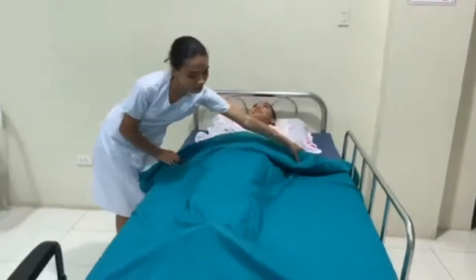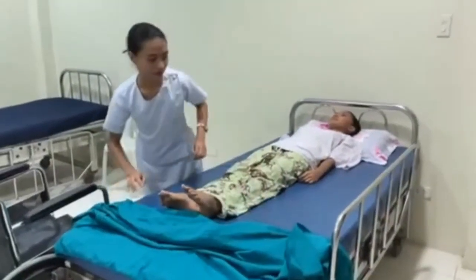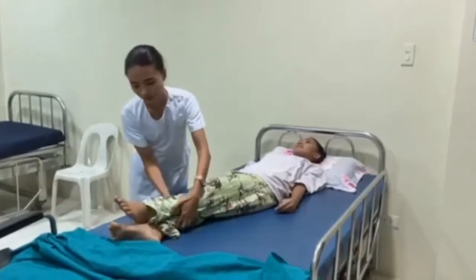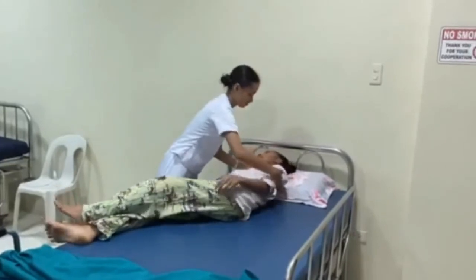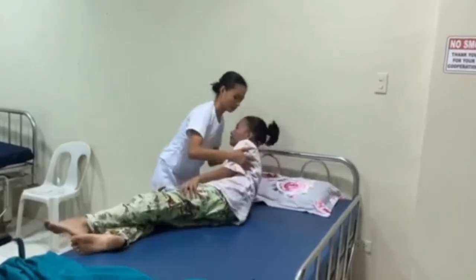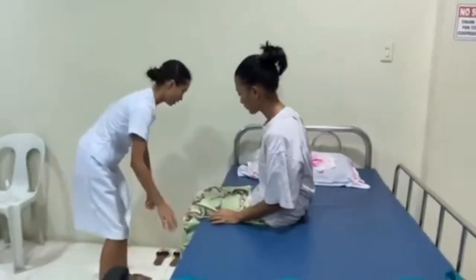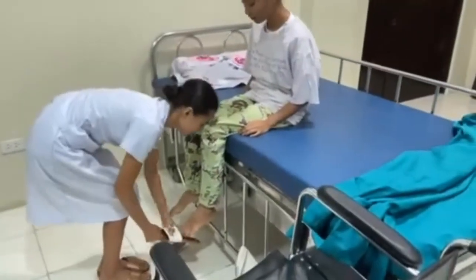Place the wheelchair or chair parallel to the bed and as close to the bed as possible. Step 2. Prepare and assess the client. Assist the client to a sitting position on the side of the bed. Assess the client for orthostatic hypotension before moving the client from the bed.